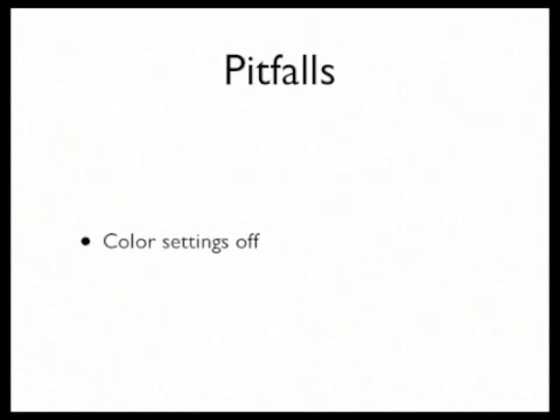That is the setting that doesn't give you any directional information, but who cares? I mean, you don't really care all that much about directional information in the testicle. You just want to see if there's flow or not. So use the power Doppler. Don't hesitate to go to that if you need to.